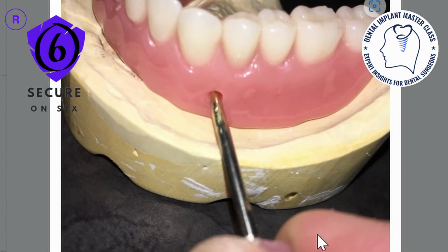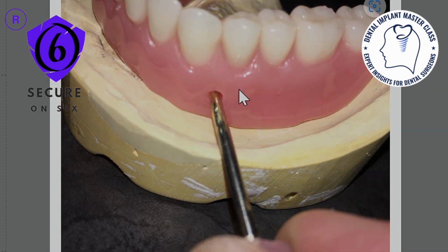Lower denture on the model. This is the left side view, showing the use of the dedicated denture removal tool or lever. Same thing, it's positioned into the hole. The patient then pushes down towards her feet, and this pops the denture up.